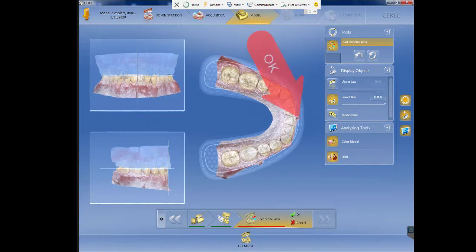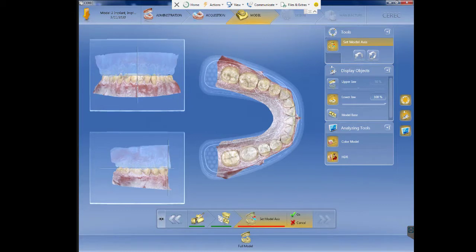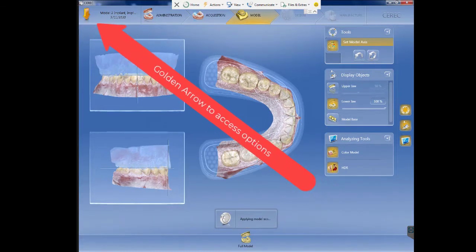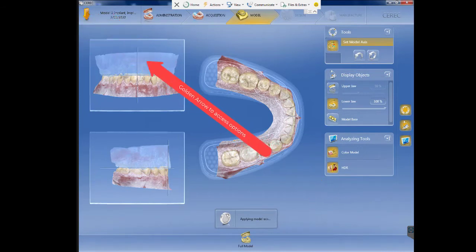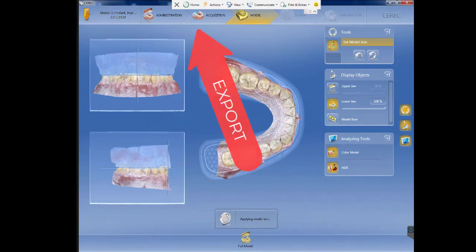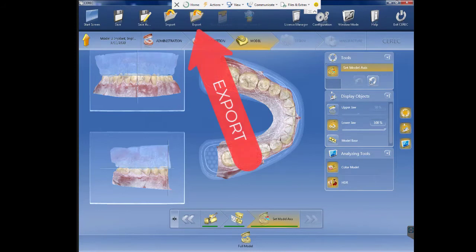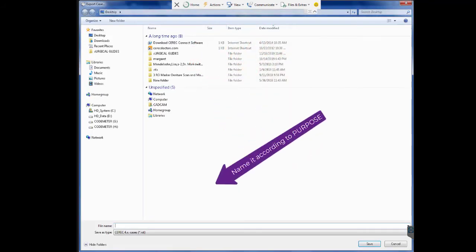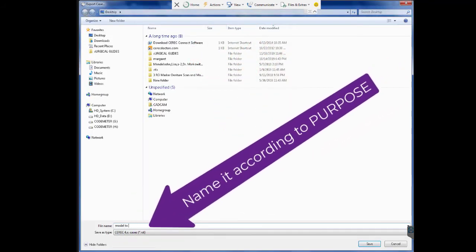You will just click OK, and after you click OK you will have this virtually mounted. Then you will click your golden arrow in CEREC to get the options. Go to export, click export, and then go and name the file in a folder that you know.